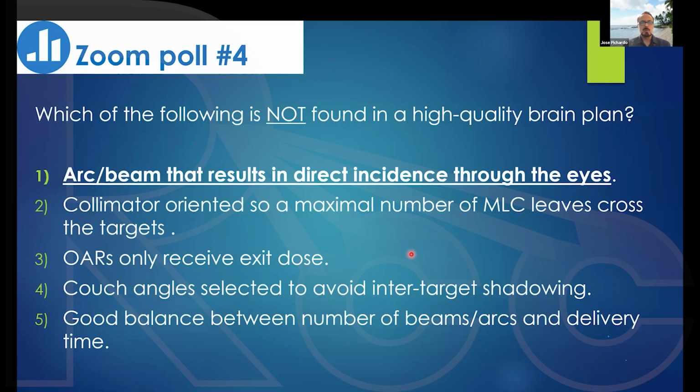So you have to consider those things. If you need more arcs to get a better plan, you may want to consider separating the lesions into 2 groups and treating them with separate isocenters.